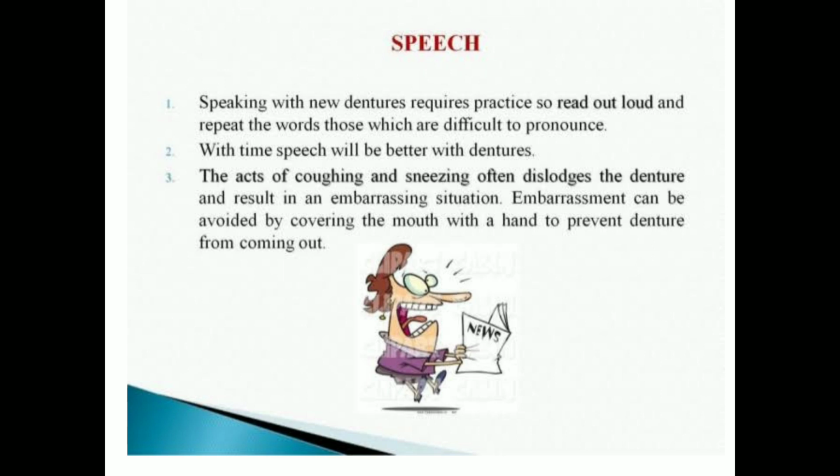Whenever he sneezes or coughs, there might be dislodgement of the denture, right? So tell the patient, don't get embarrassed. These are all the common problems that every complete denture wearer faces, right?